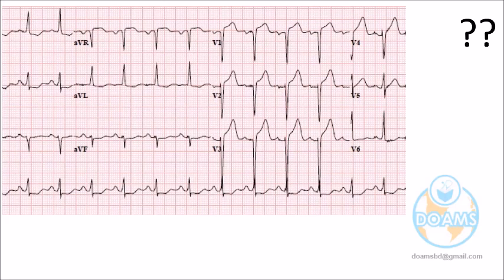QRS is okay. Okay. What is the width of the P wave here? Can you calculate from your screen? Difficult maybe. I'm trying to make it closer. Yeah, 2, 3. So it will be puzzling for you that sometimes I am confused whether the P wave is abnormal or not. The appearance of the P wave as well as the width is near about 2.5. Elevation 2.5, width also 2.5. This is normal for the P wave.